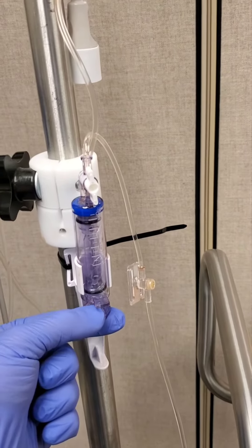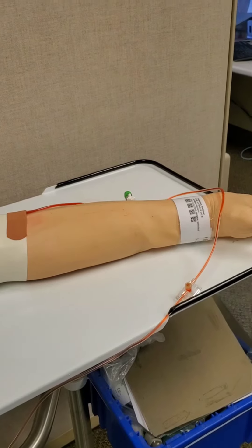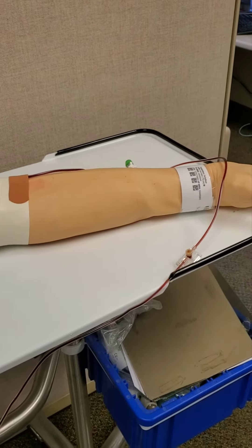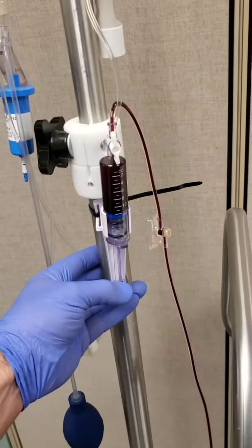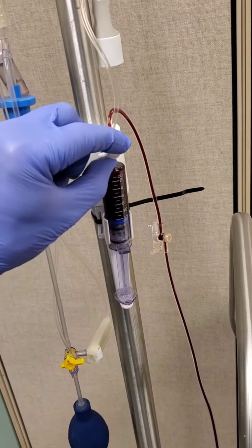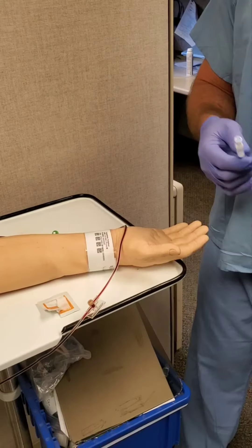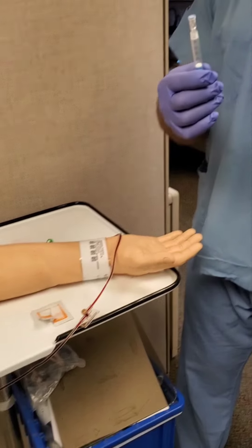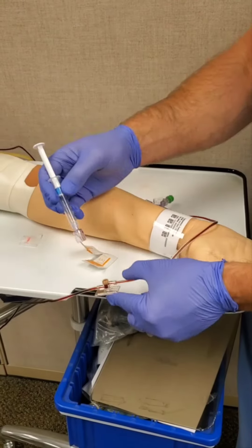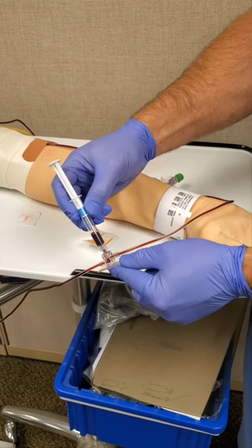Pull back on the syringe to fill the line with blood. Pull the syringe all the way down and turn the stopcock. Clean off the port with an alcohol wipe. Place the VAMP cannula onto the ABG syringe. Place the syringe on the port and allow it to fill with blood.